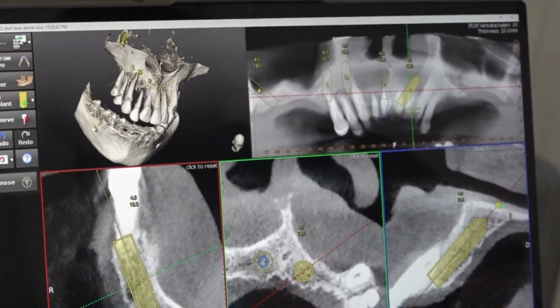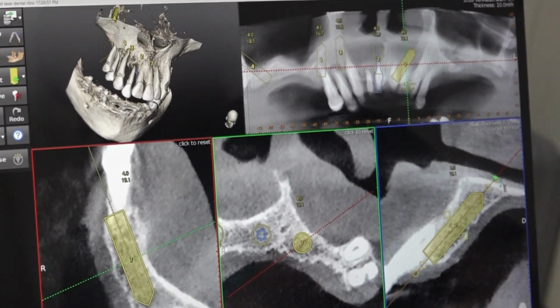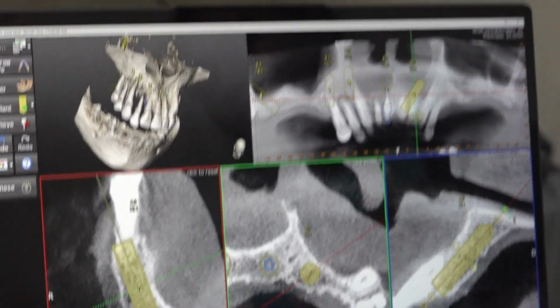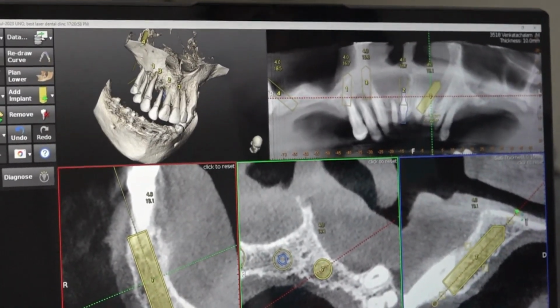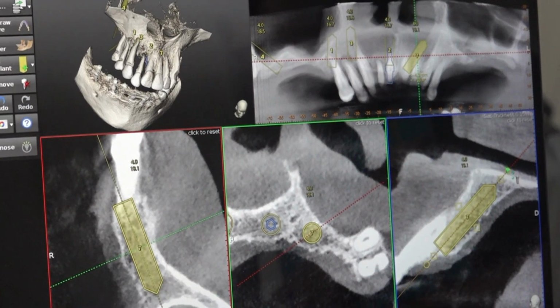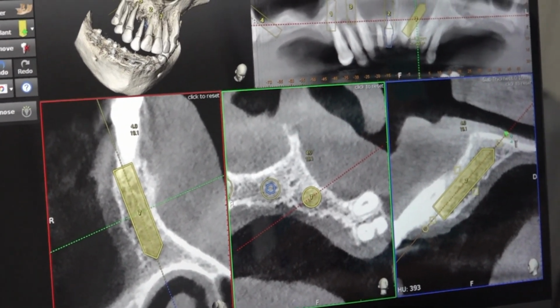Even though it is a 1-1, 2-1 implant, it is actually not in 1-1, 2-1. It is almost between 1-1 and 1-2 or 2-1 and 2-2, because to avoid the nasopalatal canal, we are moving away from the exact 1-1 or 2-1 location distally. Even though it is a 1-1 implant, it is a little closer to the 1-2 or 2-2.